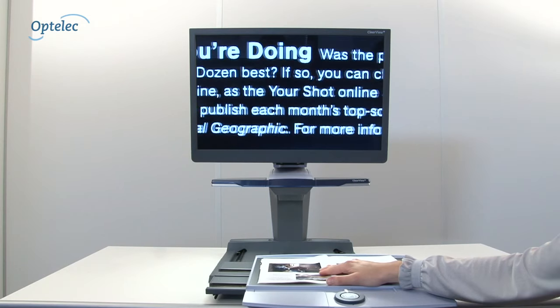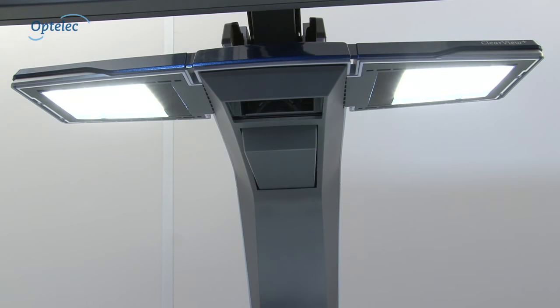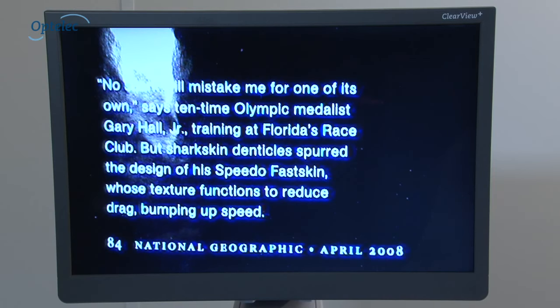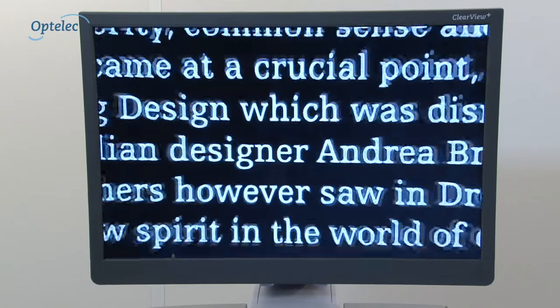Whether you are reading slowly or quickly, the Clearview Plus image remains clearly visible. The integrated light helps reduce any effect of shadows or glare. If your reading materials are shiny, you can switch off the lighting to reduce any reflections. The wide zoom range enables you to see every detail.